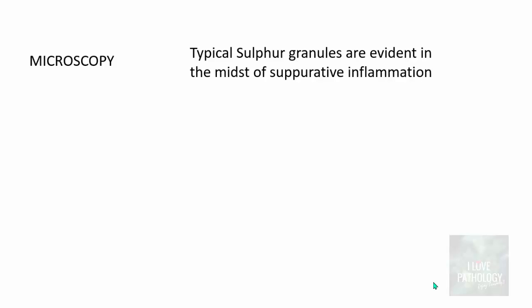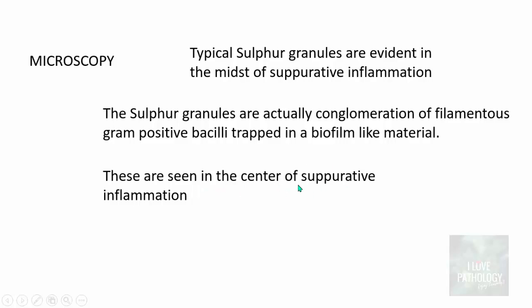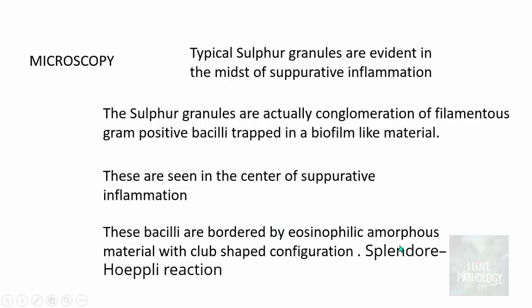Clinically, actinomycosis presents as either a lumpy jaw or a discharging sinus. On microscopy, sulphur granules are evident in the midst of suppurative inflammation. The sulphur granules are a conglomeration of filamentous gram-positive bacilli, Actinomyces israelii, trapped in a biofilm-like material. These are seen in the center of suppurative inflammation, predominantly neutrophils. The bacilli are bordered by eosinophilic amorphous material with a club-shaped configuration — that is called the Splendore-Hoeppli reaction.